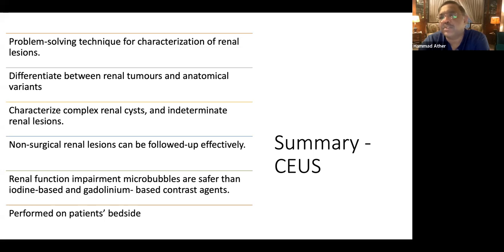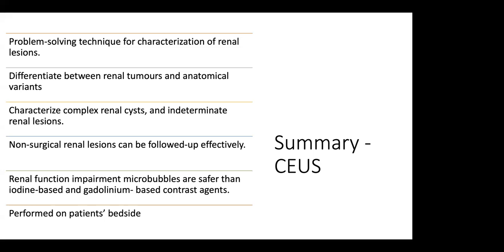Basit, would you like to comment on Mr. Munir Ahmed's observations? Yes. I think Mr. Munir has very well pointed this out, but the thing you described, 6, 5 or more injections, is true for the liver, but not for the kidney. You may require multiple injections, and that also depends on the expertise, because the liver is a big organ.